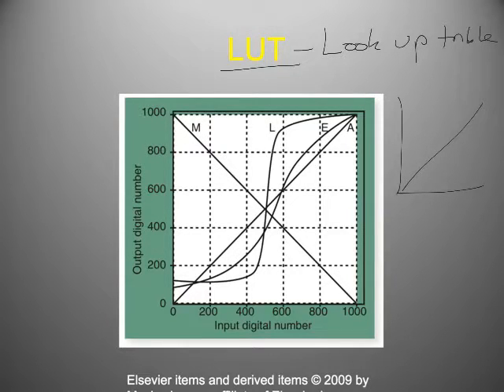So it doesn't look at it like this graph here. This is just an illustration that we can understand. It looks at it as a series of numbers. It's a matrix of numbers, right? Sometimes this is called a kernel, like in CT where we call it kerneling. So it has a matrix of numbers that it would expect to see on a hand x-ray.